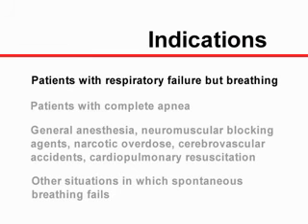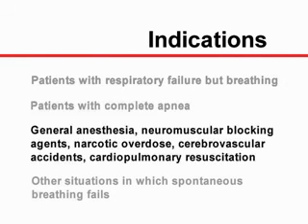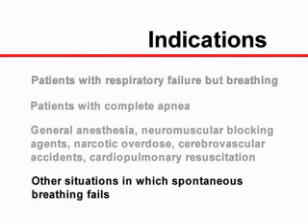Face mask ventilation is used in patients with respiratory failure but who are still spontaneously breathing, and patients with complete apnea. Face mask ventilation can be indicated after the induction of general anesthesia, the administration of neuromuscular blocking agents, narcotic overdose, cerebrovascular accidents, cardiopulmonary resuscitation, and other situations in which spontaneous breathing is failing or completely ceases.